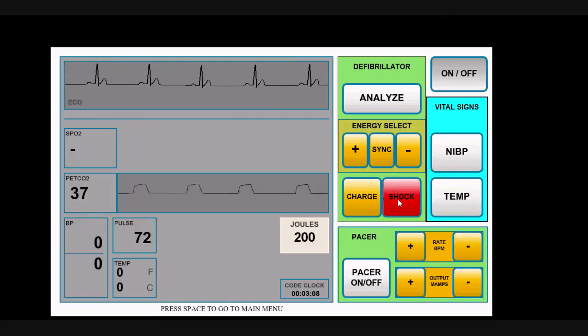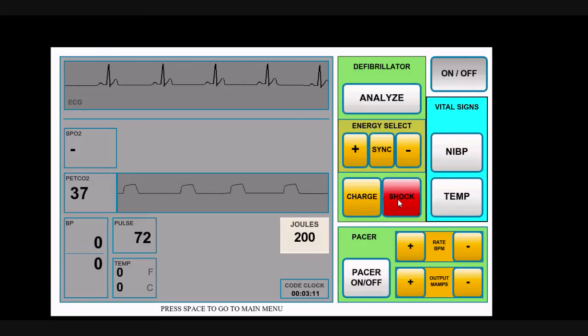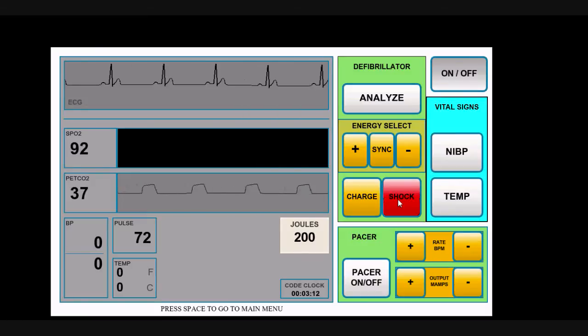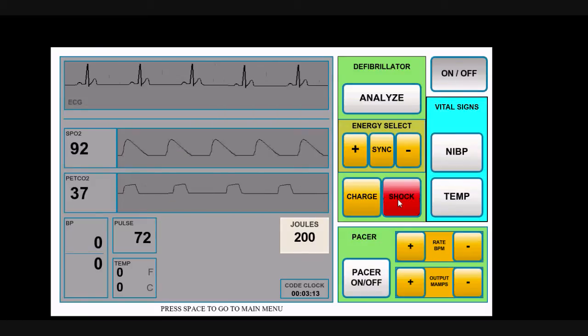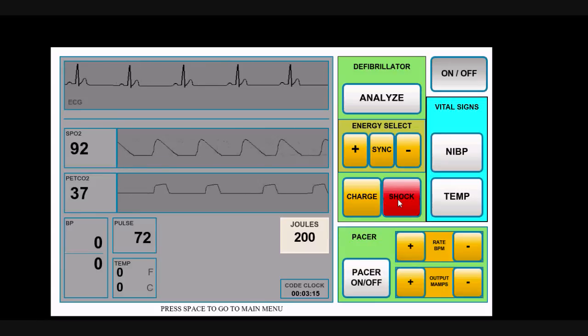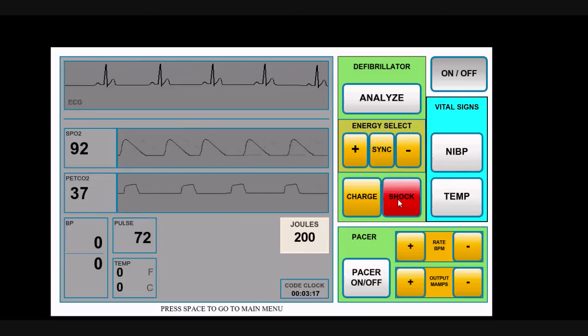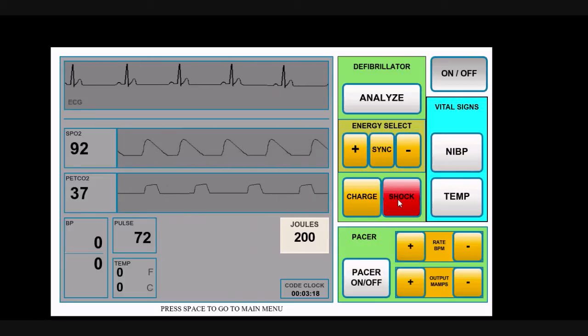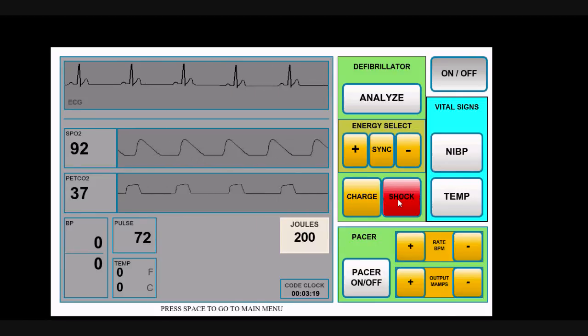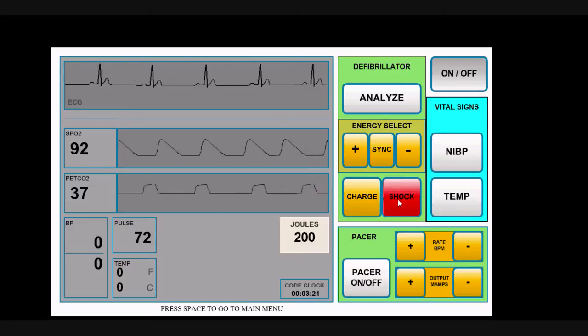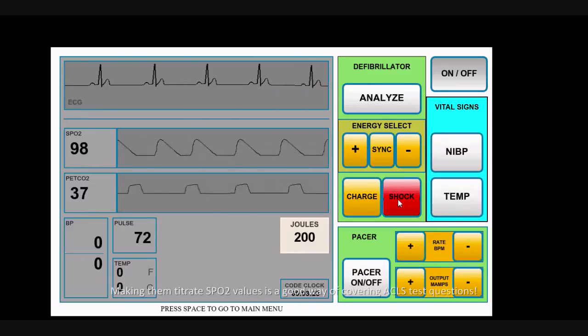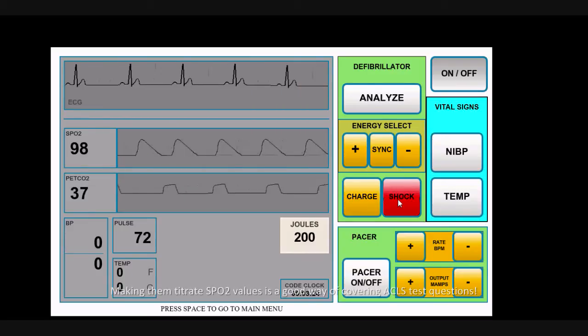You've decided you're going to give them some reward for that. Let's say they put the pulse oximetry on the patient. You've decided you're going to give them a semi-reasonable pulse ox. Let's say they ventilate the patient with 100% oxygen and you decide you want to go a little higher. You can do that.